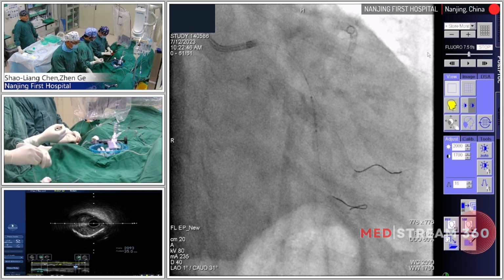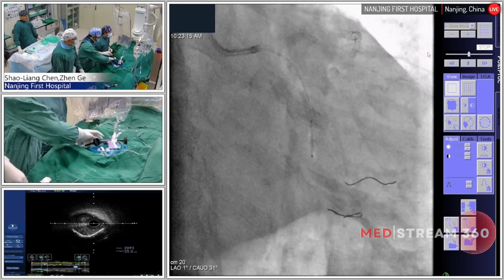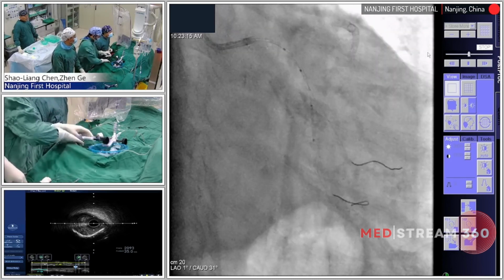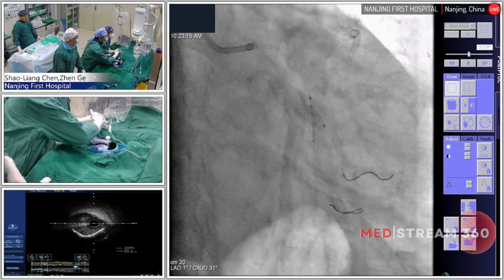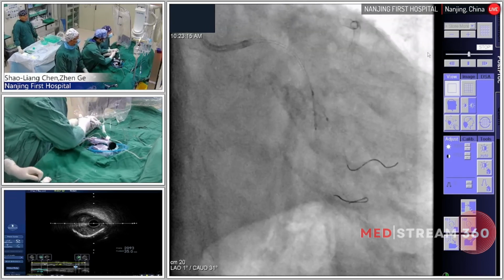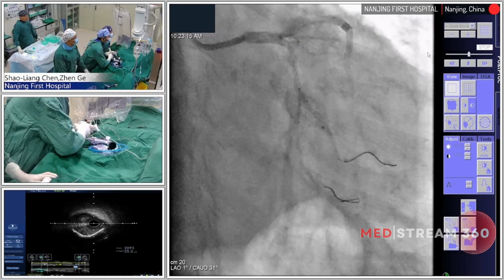Another point is that the patient is an 82 year old lady, so I think maintaining TIMI-3 blood flow is our goal. According to our criteria, the lesion could be classified as Medina 011 with a diffuse lesion in the side branch, so it would meet the criteria for a complex bifurcation lesion.